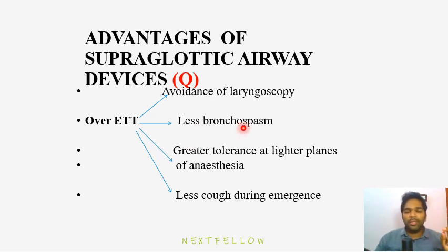And less bronchospasm. See, in endotracheal intubation, you are putting the tube into the trachea, so that may cause laryngospasm or bronchospasm. In this, the incidence of laryngospasm and bronchospasm is much less compared to that of endotracheal intubation. And greater tolerance at lighter planes.